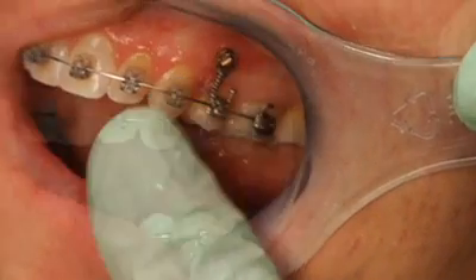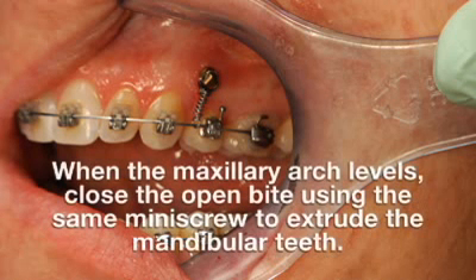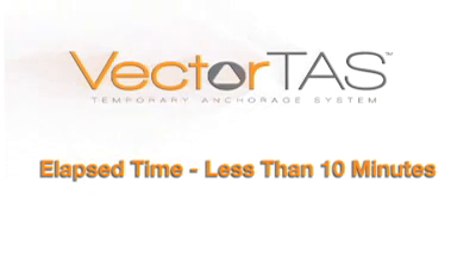As the maxillary teeth intrude, a lateral open bite will occur. When the maxillary arch levels, close the open bite using the same mini-screw to extrude the mandibular teeth. Leveling of this occlusal cant case is estimated to take about 3 to 4 months. The total procedure time was performed in less than 10 minutes.